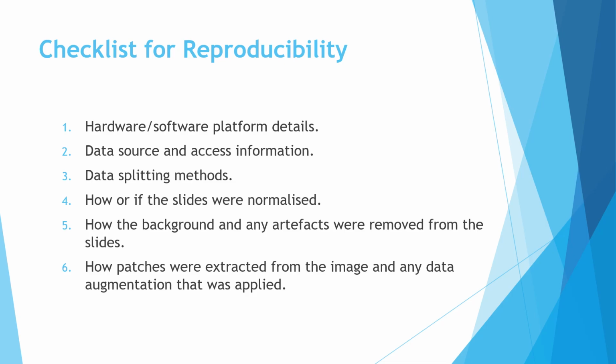And because not all the segments in the slides have the tissue, and some specific part of the slides are related to the tissue sections, some segmentation algorithm may have been used to remove the background and any artifacts in their slides. This item also needs to be reported.